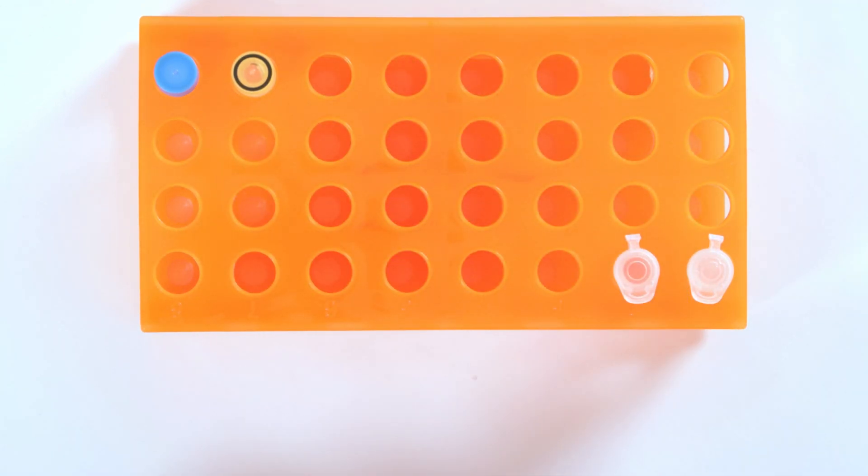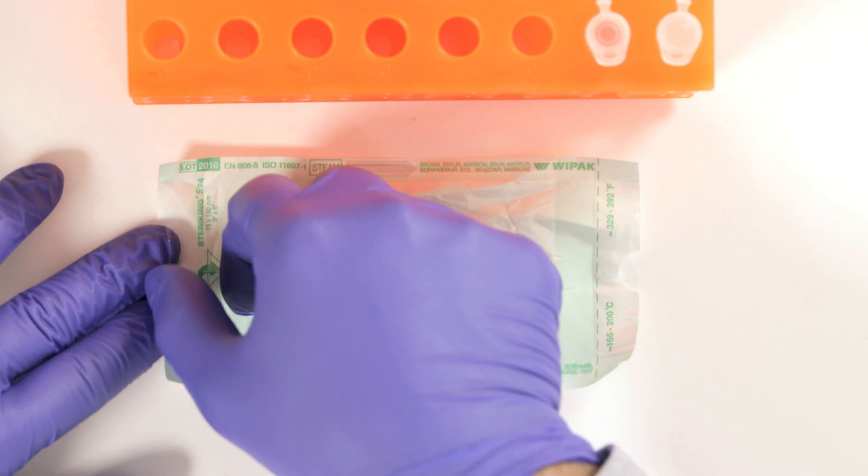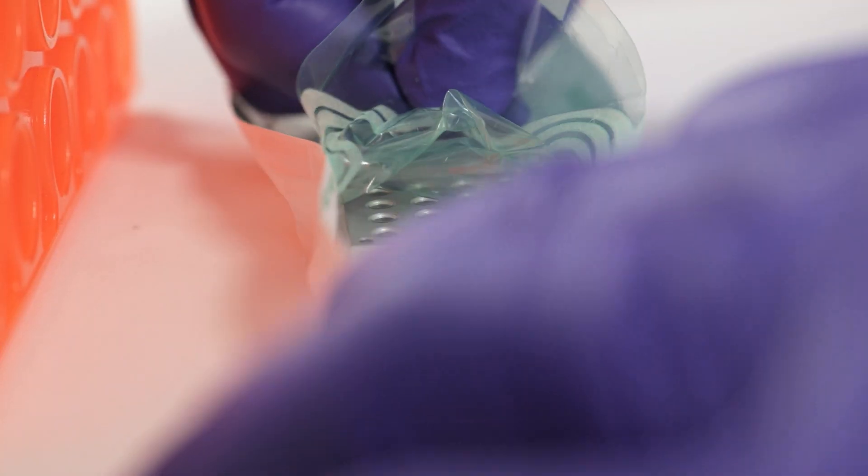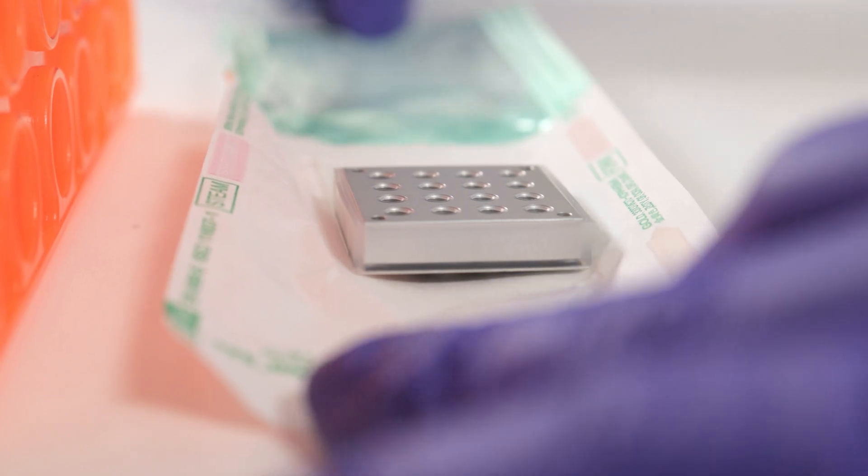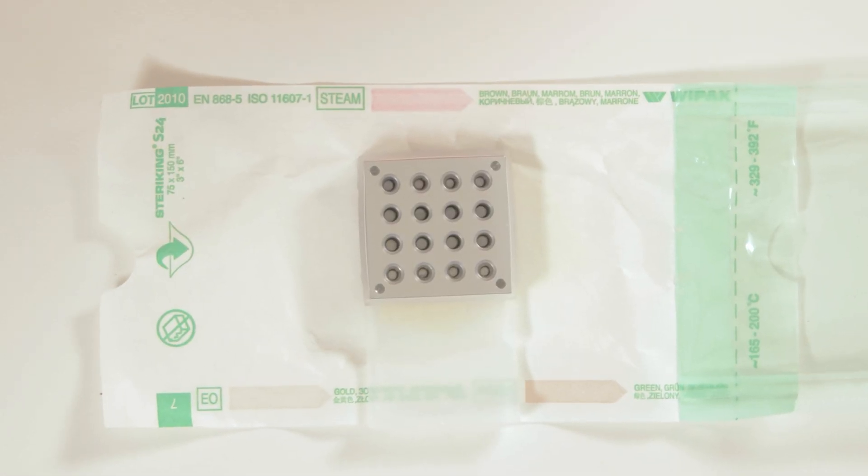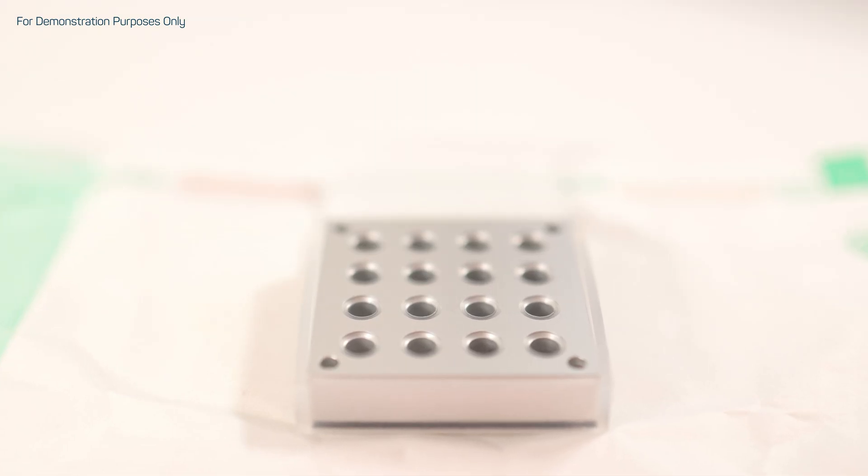When reagents from the HiRIS B-Kit are thawed, the operator can put them in place on the tube rack. Now it's time to open a brand new cartridge. Depending on the specific HiRIS B-Kit chosen, up to 6 or 16 tests can be run simultaneously thanks to the format of the included HiRIS cartridge.